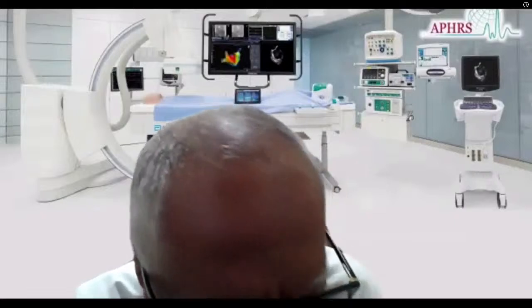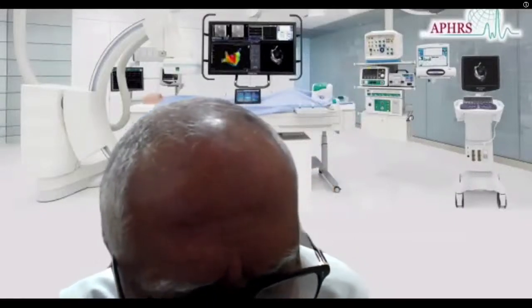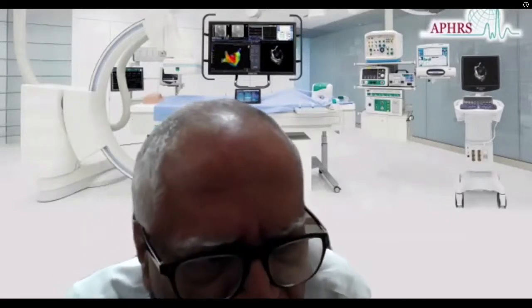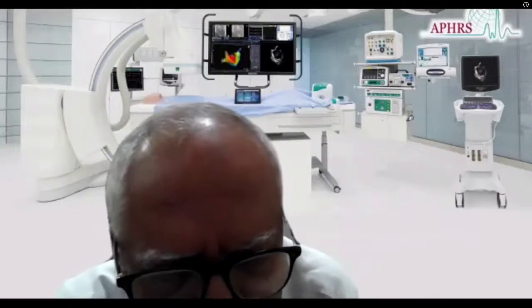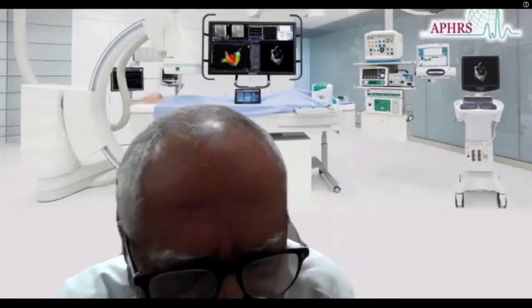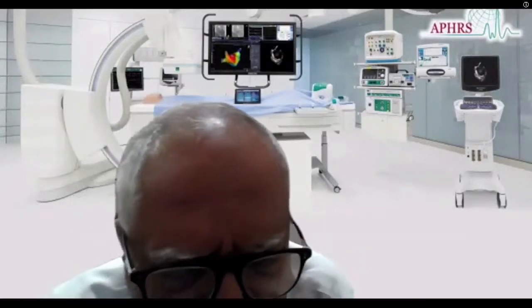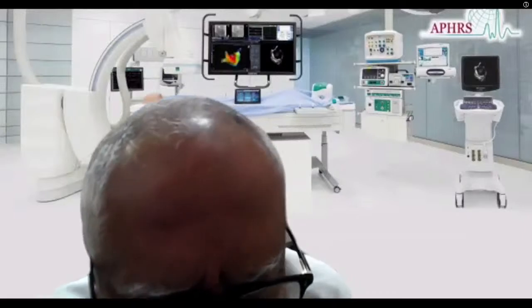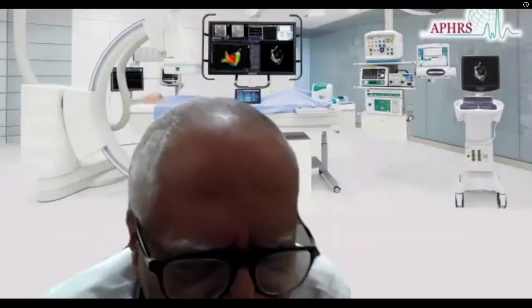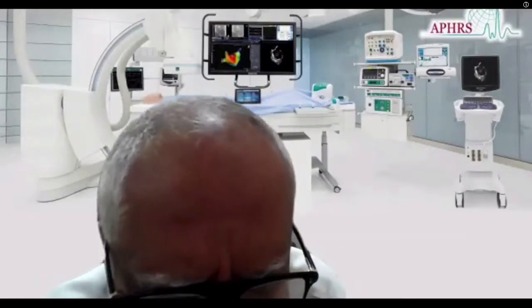When you do ventricular overdrive pacing, the return beat post-pacing interval minus tachycardia cycle length (PPI minus TCL) will usually be more than 110, 120 milliseconds in AVNRT, much longer, 130, 140. Whereas in a septal accessory pathway, because you are directly entering the V, the return beat will come much faster. So PPI minus TCL will be around 80, 90.